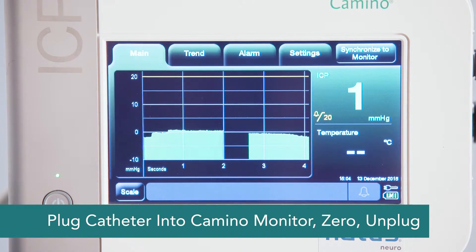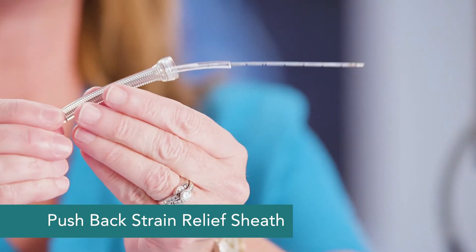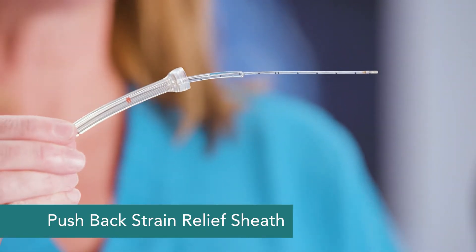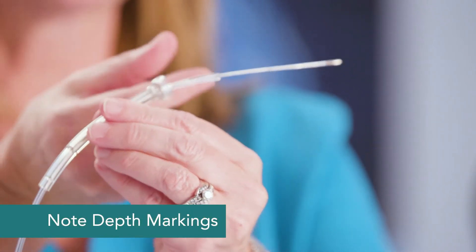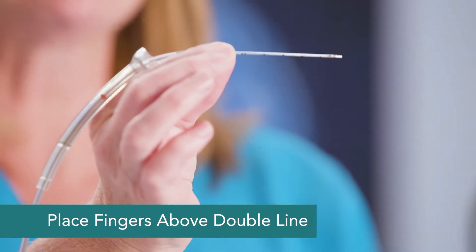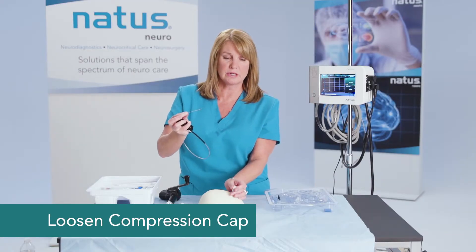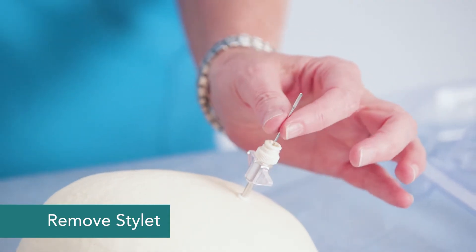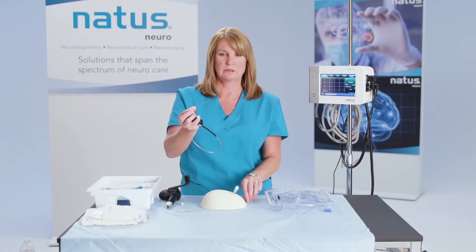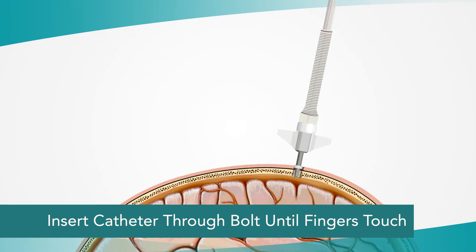Once your catheter is zeroed, go ahead and place it. Take your strain relief sheath and push it back so that you can see the depth markings on the catheter — they're marked off in centimeters. You can see where the double line is; put your fingers right above that double line. Take the other hand and loosen the compression cap, slide the stylet out, then take the catheter and insert it through the bolt until your fingers touch.